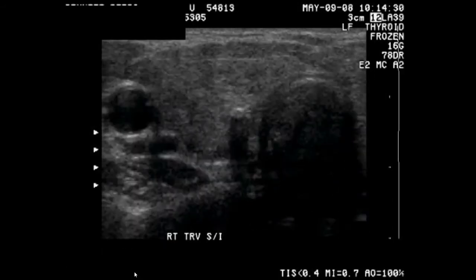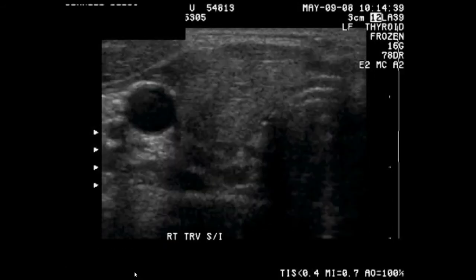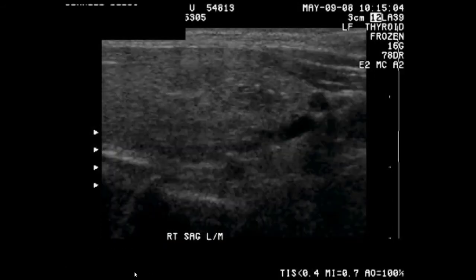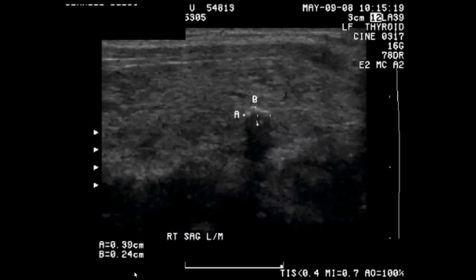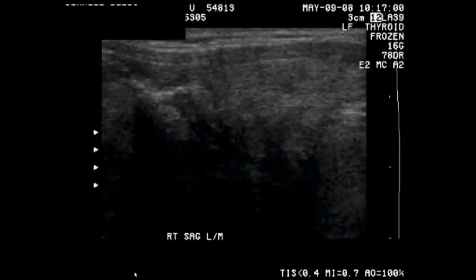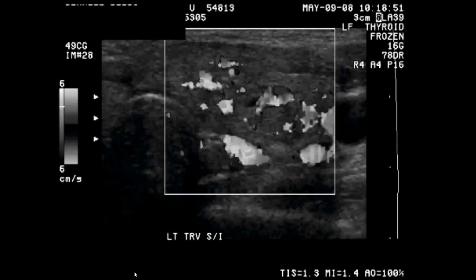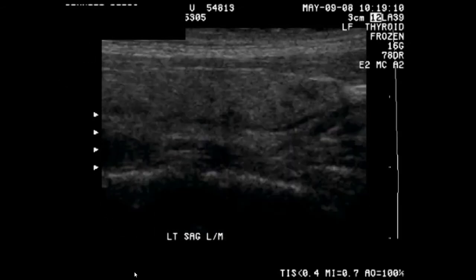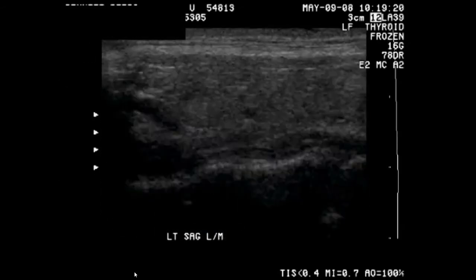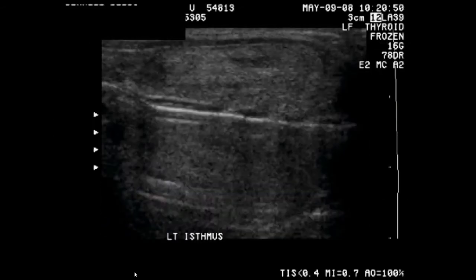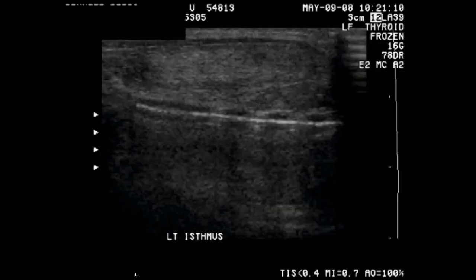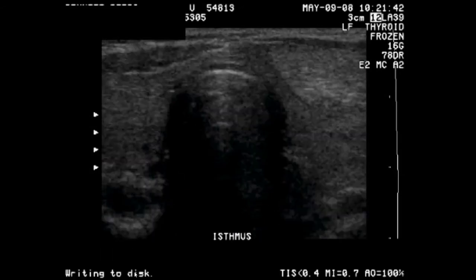The most common test to assess a thyroid gland is a thyroid ultrasound. Here we see another example of this test. In these images, Doppler imaging also checks for blood flow through the gland.